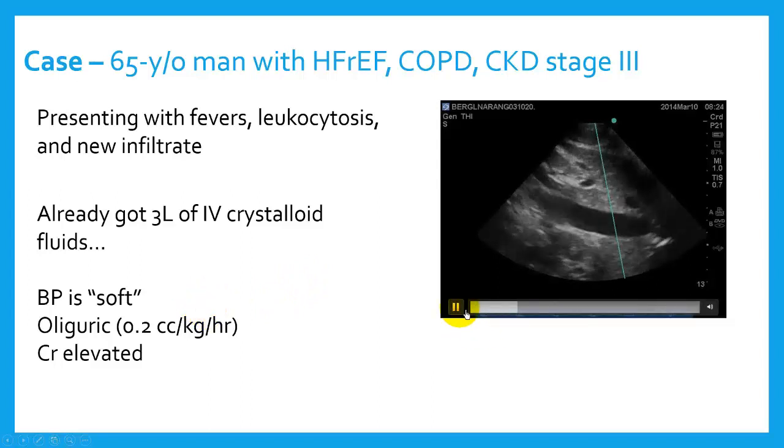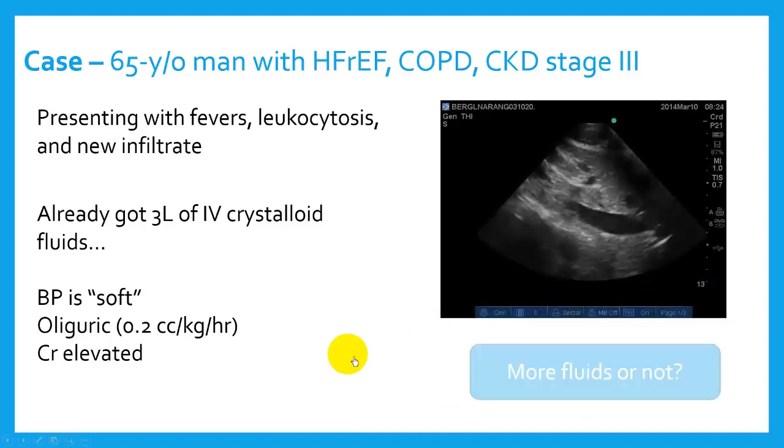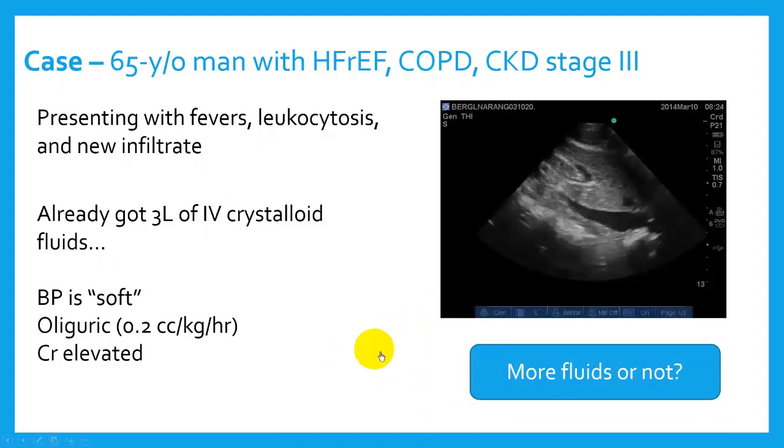And we get this type of IVC ultrasound. And we're sitting there at the bedside, and we're really just wondering what you're probably wondering: should I give him more fluids or not? And the answer is, I don't know.